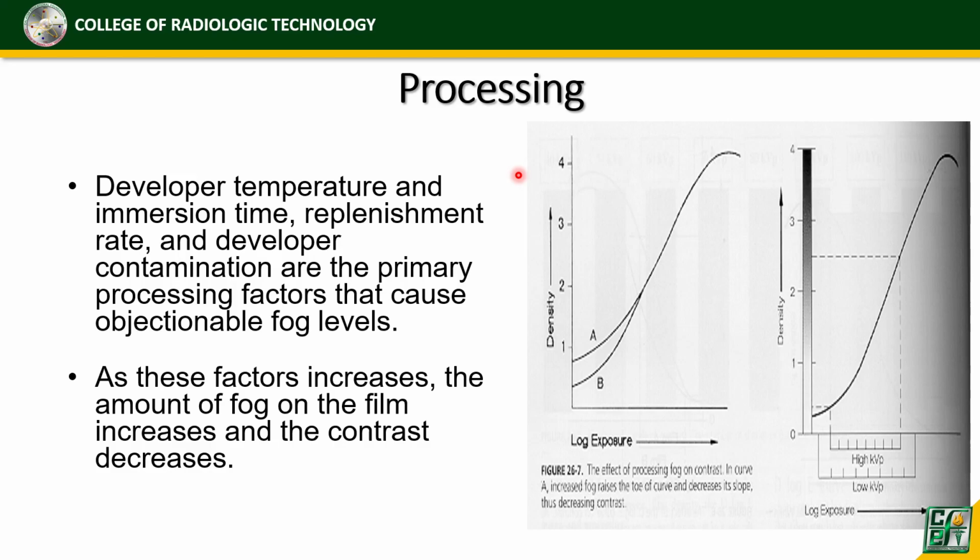Ano mangyayari kapag masyadong mainit ang temperature ng developer? Masusunog. Very good, masusunog yung image. Okay. Siyempre, kung sunog yung image, wala tayong radiographic contrast. Okay?